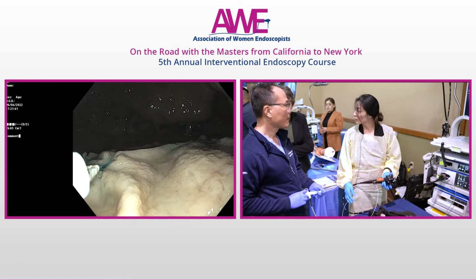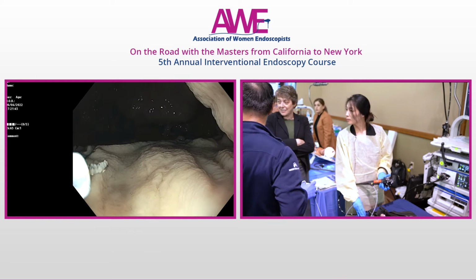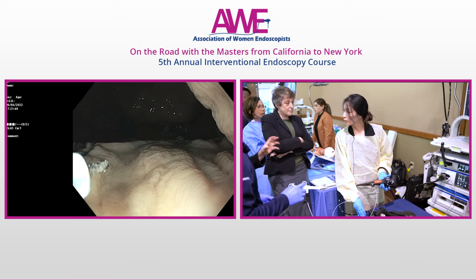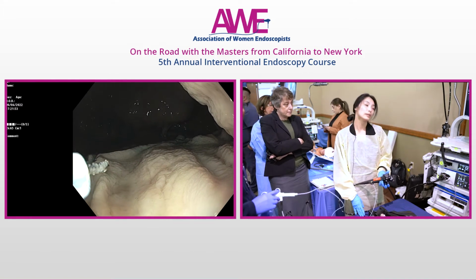Linda, I think Dr. Krinsky had a question for you. I just was wondering if there's any other tips when you use suctioning to grab the entire polyp. Any other tricks if it continues to slip?